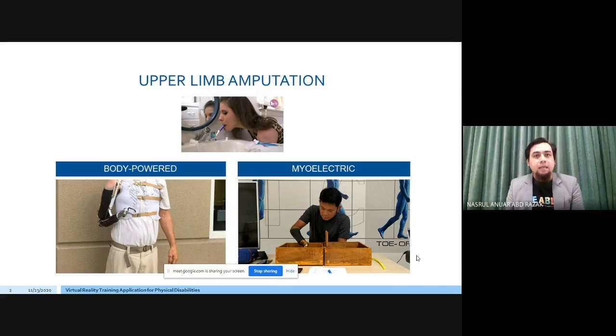Once we have the activation of the muscles, only then can we figure out where we want to put the EMG sensor. Once we figure out the EMG sensor, only then can we figure out what the position could be inside the interface of a prosthetic device, a prosthetic socket, for example. This is a bit difficult and tough as well, because the human body changes 0.06% daily. No matter whether you are walking or standing, your body weight is actually plus 0.06 and minus 0.06 in a second.